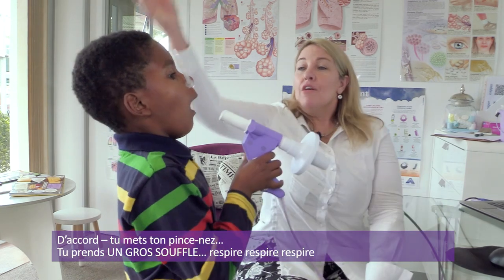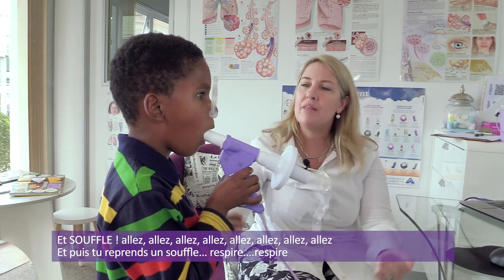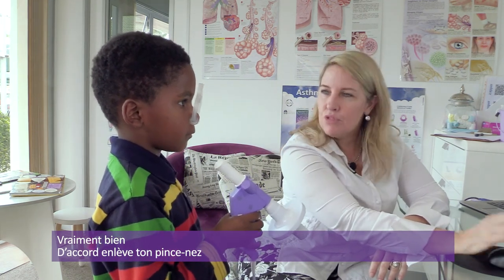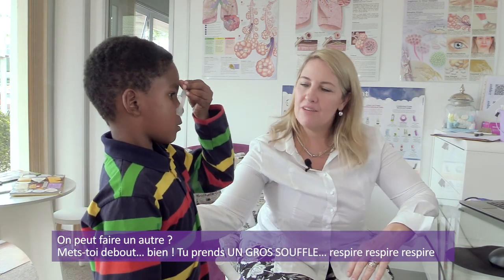Okay, big one. Fast as you can. Go. And breathe in. Breathe in, breathe in. Okay, good. And relax. That one was very good. Well done. That was beautiful. Okay, take your nose clips off. Good. Okay, just rest for a moment. Okay, can we do another one? Riley, okay, you can stand. Good boy. Well done. Okay, you ready?